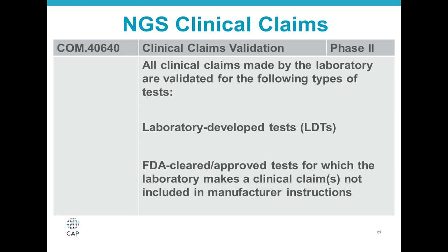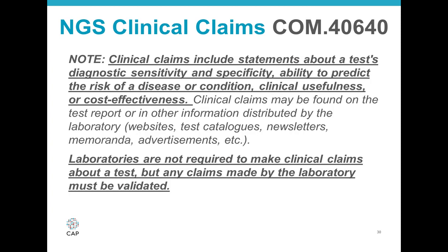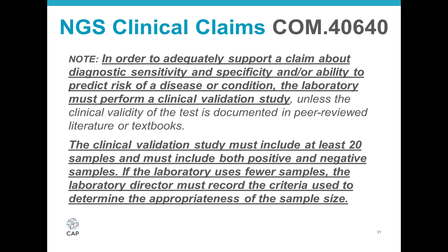An item from the all-common checklist applicable to next-generation sequencing-based testing requires that any clinical claims made by the laboratory must be validated for all laboratory-developed tests. Some examples of clinical claims might include statements about the diagnostic sensitivity and specificity of the testing, the ability to predict risk of disease. It might be statements relative to the clinical usefulness of a test or even its cost effectiveness.